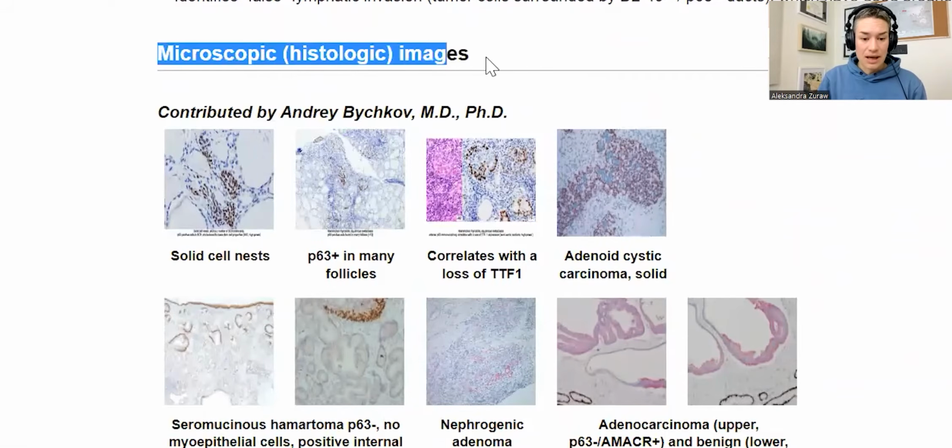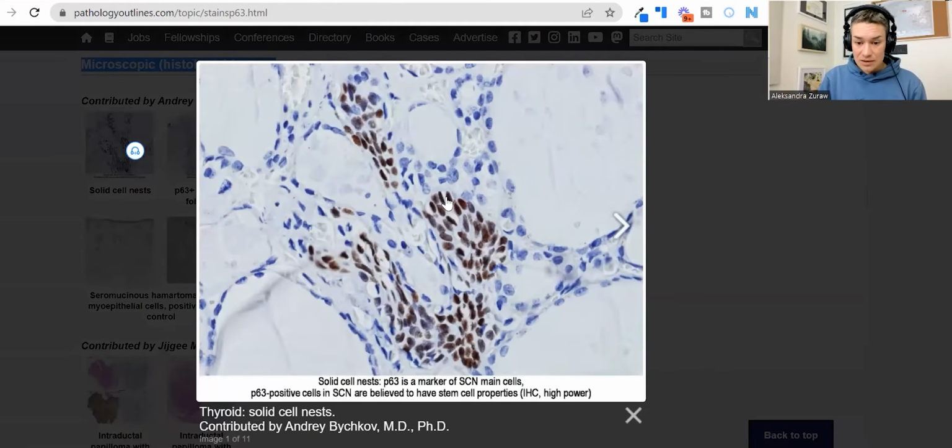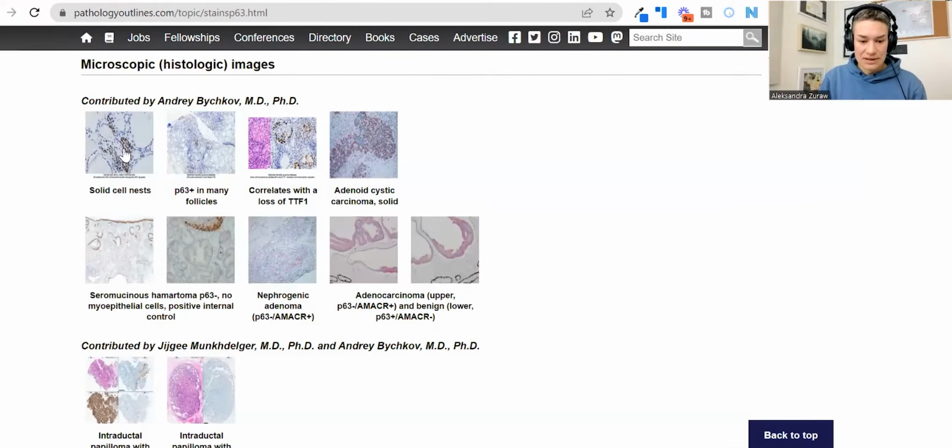And here you're going to have images of this. So these are static images, but basically, let's check this one. You see that it's in the nuclei, and this is how it should look. Is there any background? Not really any background. This is like perfect, but you can see, obviously, whichever IHC picture online you will be looking up, for example, we have other resources as well, but whichever companies that sell antibodies, they often give pictures, how it looks. It's gonna look like the most perfect. It's the same principle as a publication images. You pick the best image. You don't show like the whole spectrum. You pick the best image. So you will know that this is the best image, and you will have here other appearances of this.